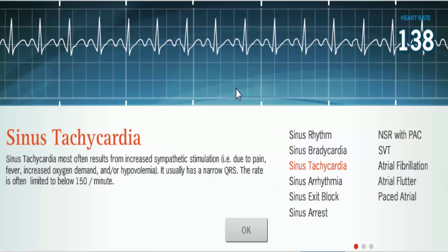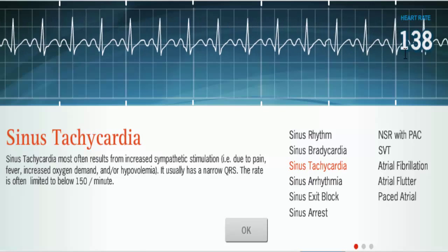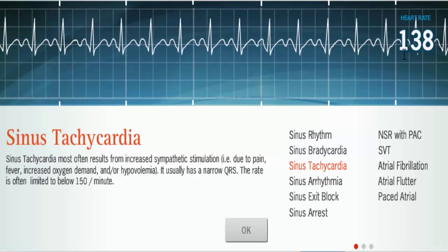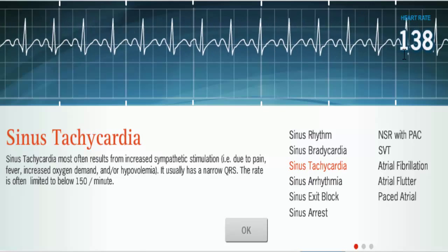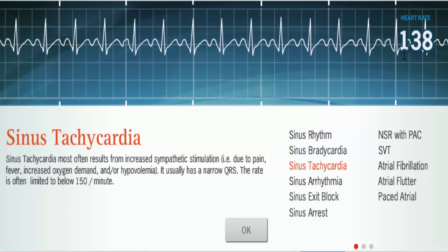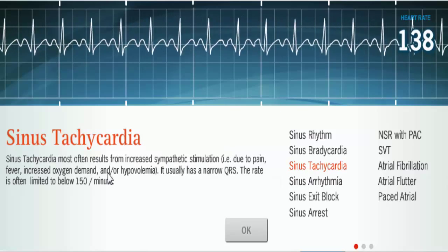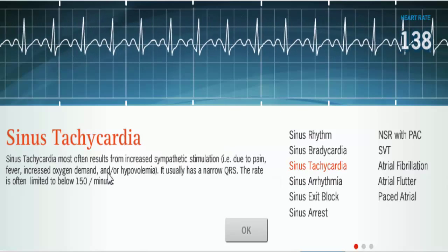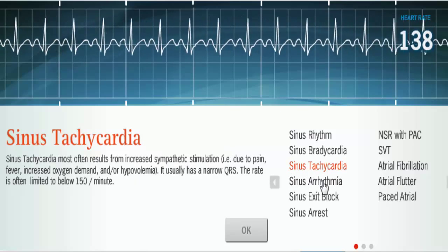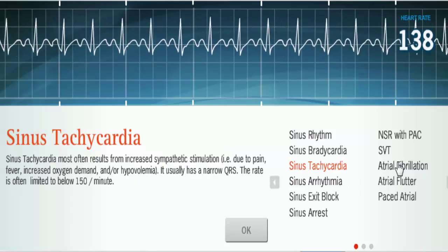Let's look at sinus tachycardia. With sinus tach, you still have your P wave, QRS, and T — it's just that the rate is faster, usually under 150 or so. That's sinus tachycardia.